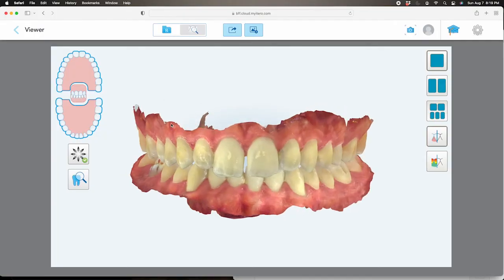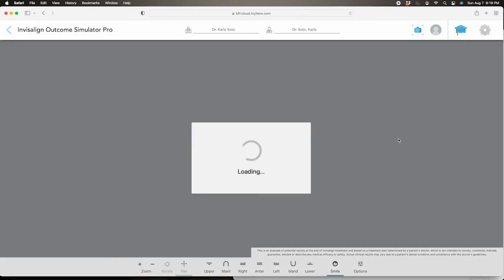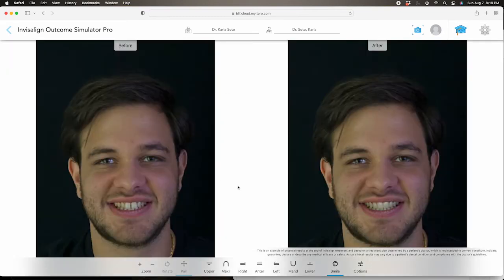So, of course, that's what looks a little bit different, and you can click on it. You have to give it a little bit to load. It's a lot of information; it's basically loading the whole simulation. This particular patient, handsome guy, just came for a limited exam, but because we have the power of this, he came for a completely different thing. We have the power of visualization, and we're able to show him what's going on with that gap and how it would look once it's closed.